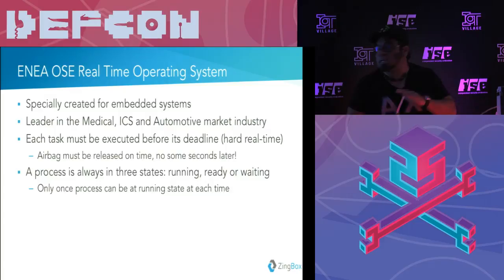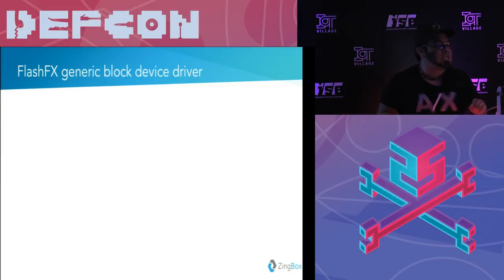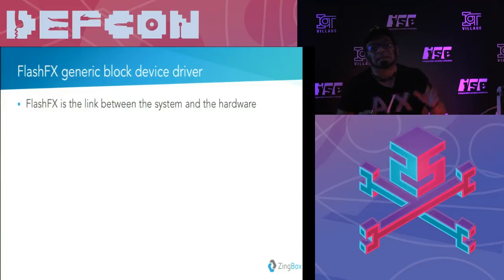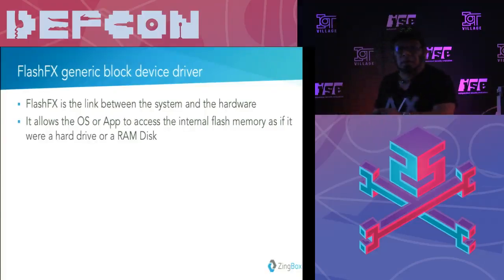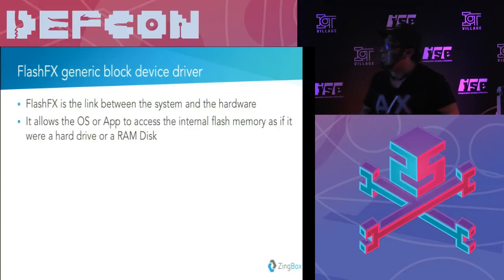Another detail: in this specific architecture, only one process runs at a time. We will see that in a second. And here is a second thing that I found inside, which is called Flash FX. This is a generic block device driver, which is basically the interface between the system and the hardware. The good thing about this, from a security perspective, is that this flash driver allows you to talk to the flash, which is in the chip, as a normal mounted drive. This facility allows you to easily play with the flash instead of doing it the hard way.